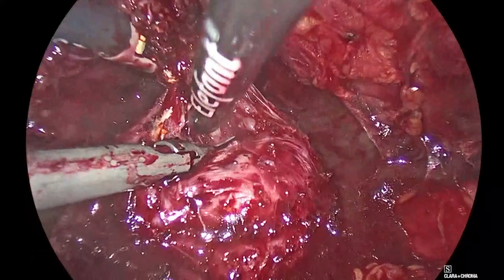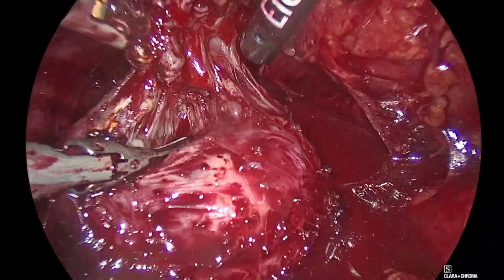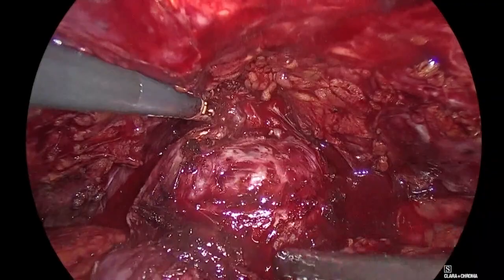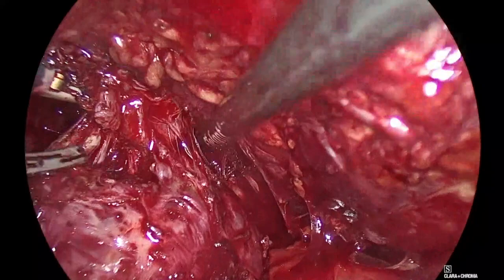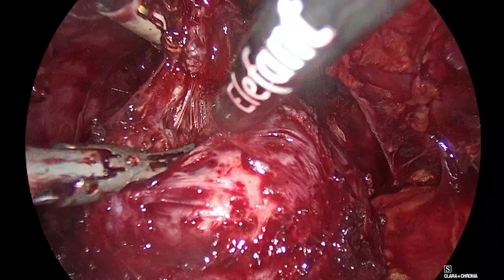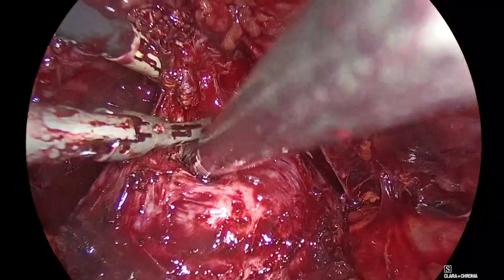Of course. Okay, pull the catheter back a bit. Catheter in. Good. Aspirate, Panagiotis, to the right. Good. Stay there with the catheter. Good. Come in. Do you do any frozen sections or the like? I normally don't, but we can do according to what they want here. Aspirate here, Panagiotis. In here. Good. I want to see the catheter. Pull down, Panagiotis, like this. Okay, good. Come, Padeli, show me. Go, Panagiotis. Go.